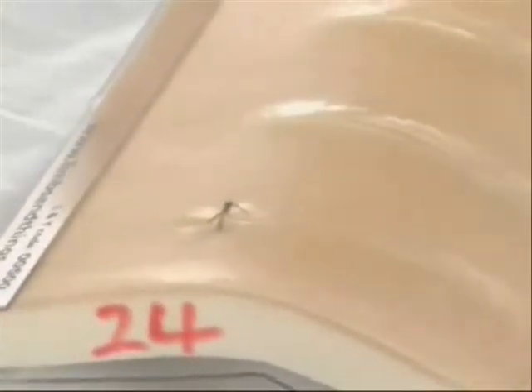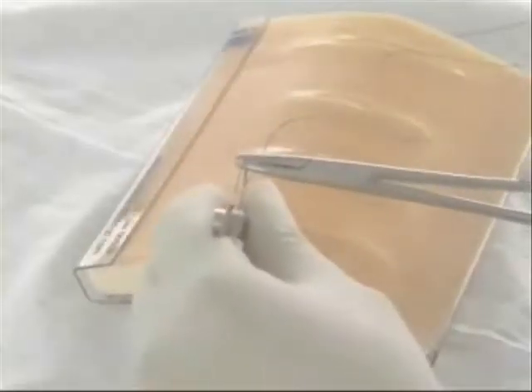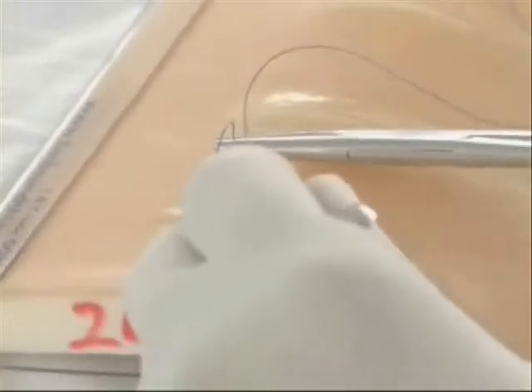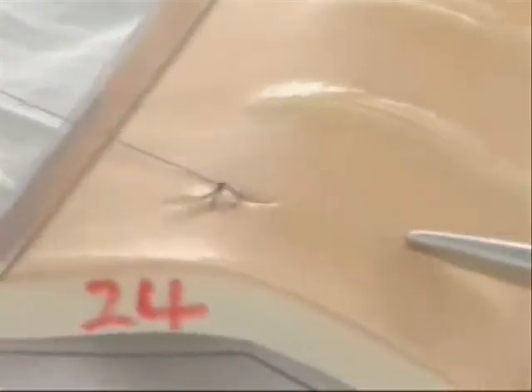Then I can go on to put the next suture. Again, we take point five centimeters, point five centimeters, and follow the curvature of the needle. Keep to the side, and I can use hand or instrument. Right here I use an instrument. Using a surgeon's knot here.